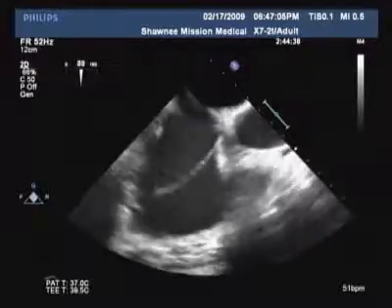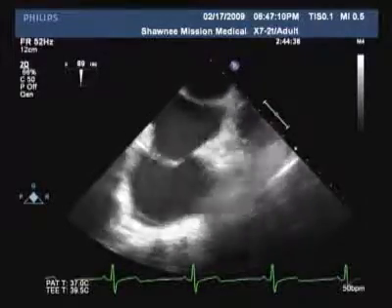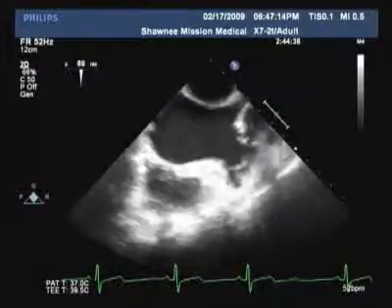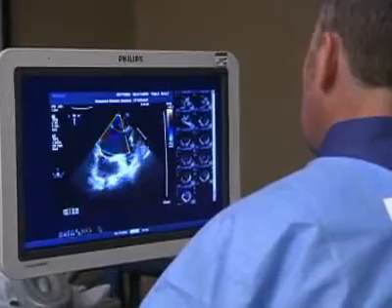Are we able to do a bubble study tonight or not? Yeah, I absolutely am. I'm just going to look at another view here. Again, that septum is up on top. And what I'm going to do is put some color across there again. I just want to make sure you get really good images. Make sure nothing's going across here.